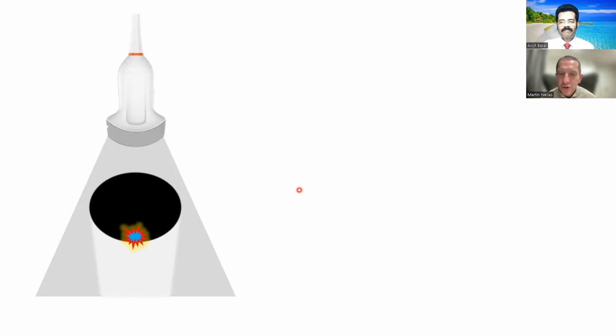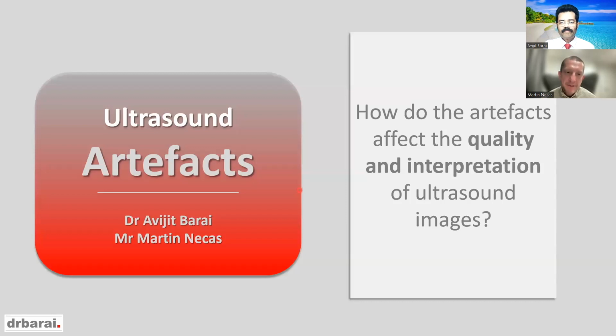It's so useful to do this because sometimes you might not be able to determine on B mode whether it's a stone or not. So the twinkling artifact is fantastic for that reason. And twinkling artifact is only associated with rough structures. So kidney stones are generally rough, as opposed to gallstones, which are more faceted and smoother. They don't tend to twinkle so much, but then they're easier to diagnose. Yeah, so this is one of the examples where an artifact is actually helpful to diagnose things. Absolutely, yeah.